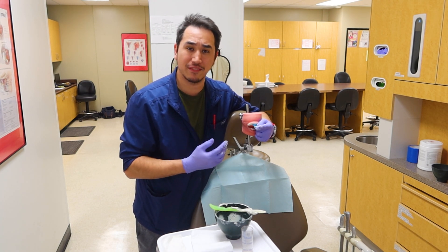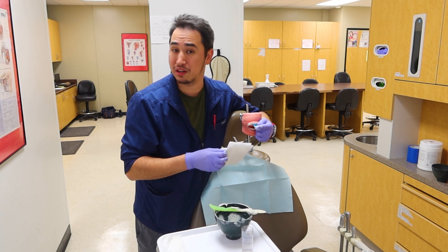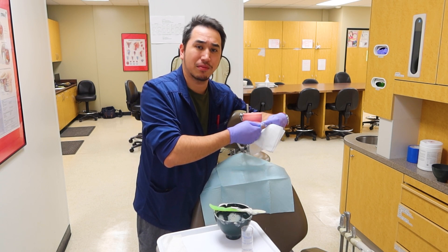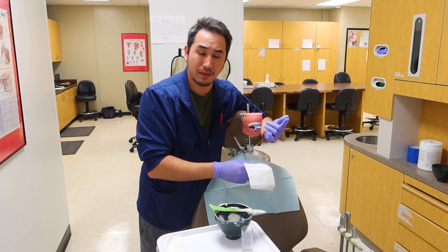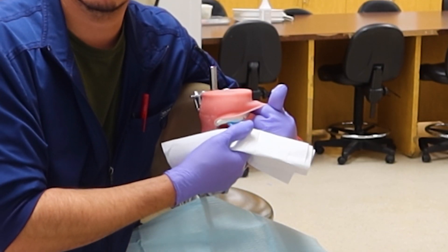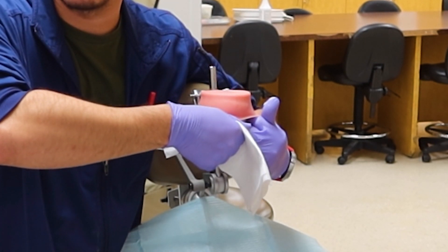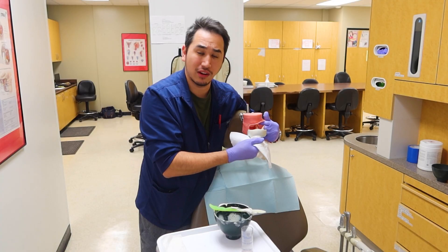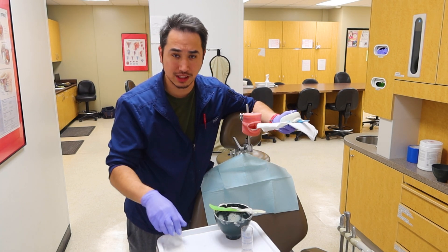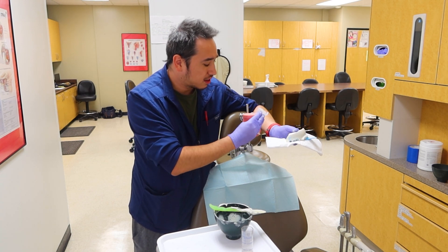Word to the wise: apart from having all this goo in their mouth, they're going to start salivating a lot, so have the saliva ejector nearby or a paper towel ready for when we pull out — a lot of gooey saliva is going to come out with it. Hold your paper towel, take the impression by the handle, and rock it a little bit. Sneak one of your fingers in there — get it up into the mucosal area and dislodge it from the top, and you'll feel and hear a suction. Now you've broken that seal, rock the other side, then come out, holding the paper towel right underneath to catch all the goo that drags out.